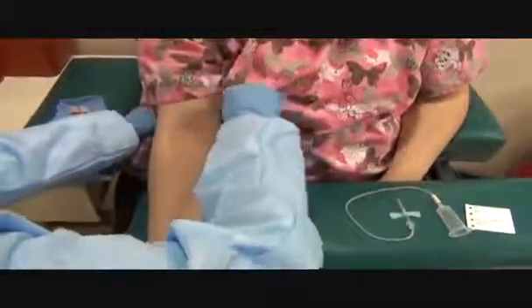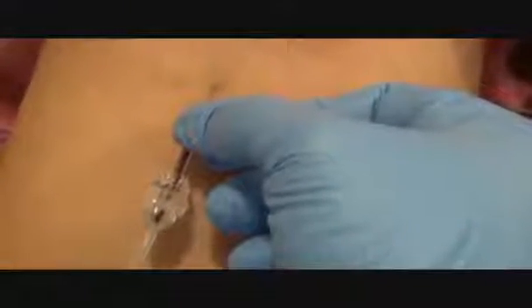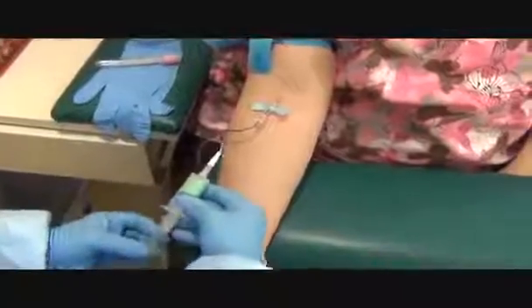Does it feel dry? Yes. Tie the tourniquet 4 inches above the site again. Make a fist. Put your arm straight. I want to make sure I hold the wings, anchor the skin, and thread the needle in. I got a flash of blood. Before I let go of the wings, I want to grab my hub. Let it go.